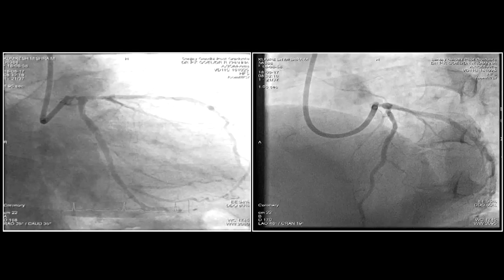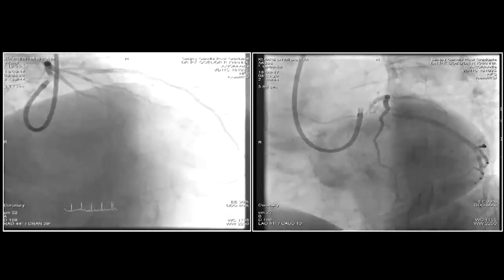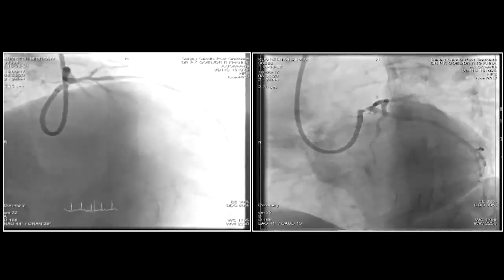Basically, when you see an angiogram, you should see the complete bifurcation in one projection. Yes, I agree. But my question is to show a projection which can clearly show the ostium of the circumflex and LAD properly. None of the projections shows a proper ostial circumflex and ostial LAD. I would preferably go for an LAO 60-40, where you can see the bifurcation exactly.